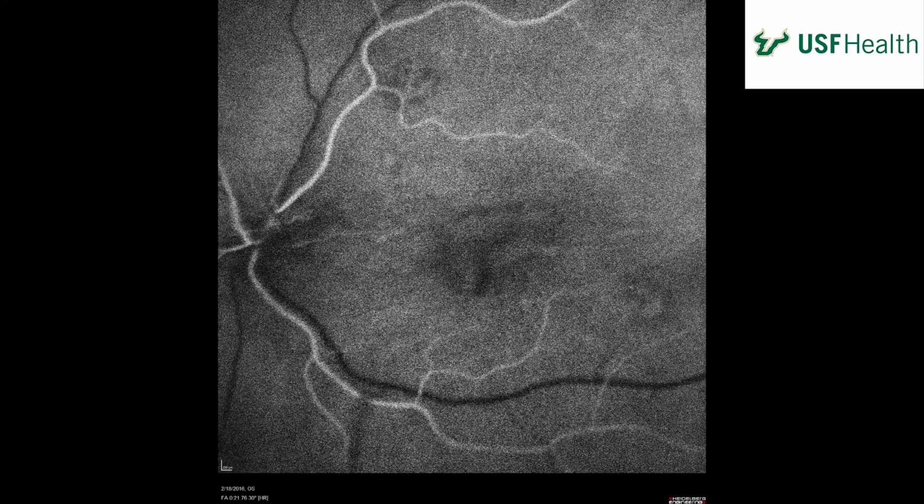This is actually autofluorescence. So there's nothing going on in that lesion. In the very first images, you'll sometimes see autofluorescence, and then as the signal goes up, that'll disappear. Like this one. Yeah. So this is a very early image. So that's just autofluorescence initially. Correct me if I'm wrong, but I thought that once you started getting the filling of the arterioles, the fundus autofluorescence was sort of over at that point. Was I mistaken? It should. No, it should. But this is a really autofluorescent lesion.